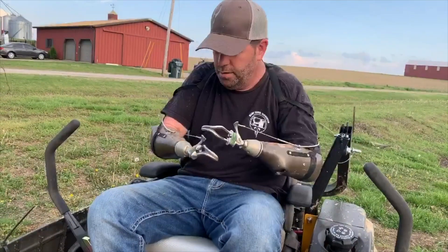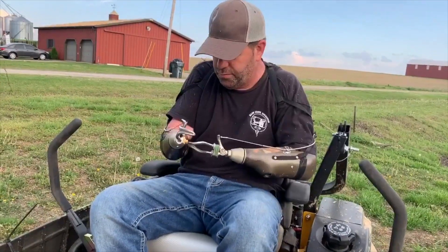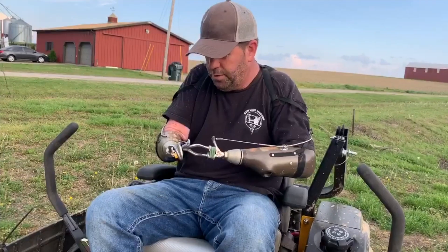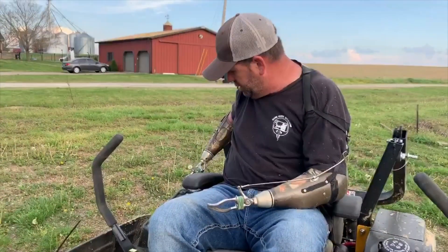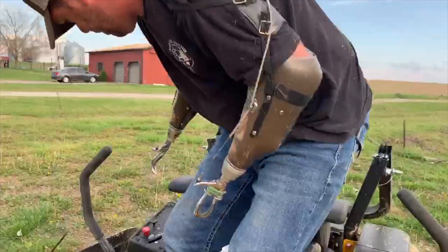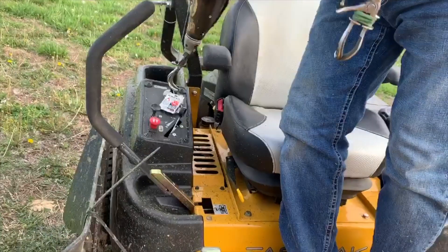As a bilateral arm amputee, wrist rotators are very, very helpful and essential to be successful in everything you do. Over here where I started, just the position of how I start this lawnmower — I usually have to stand up in order to get it to turn on. I'm not going to turn it on just because of the noise.